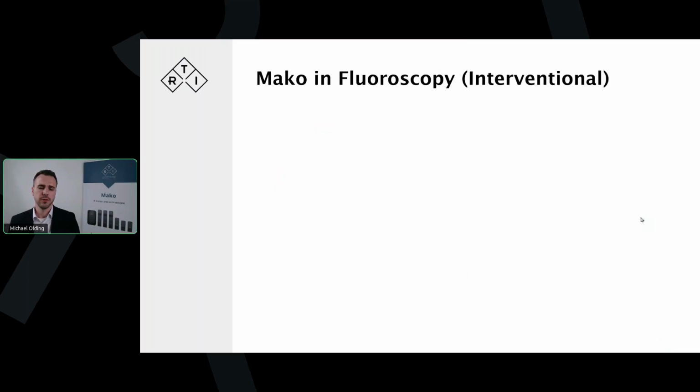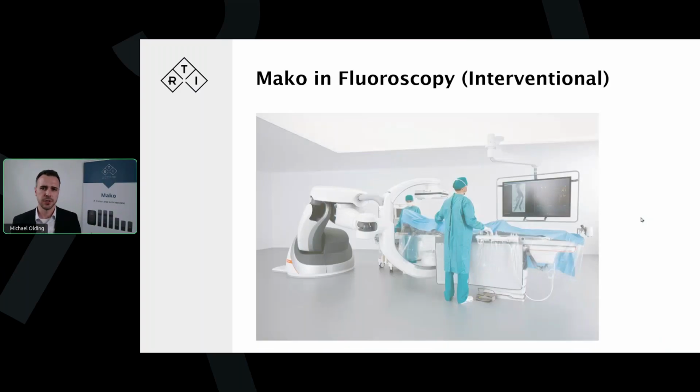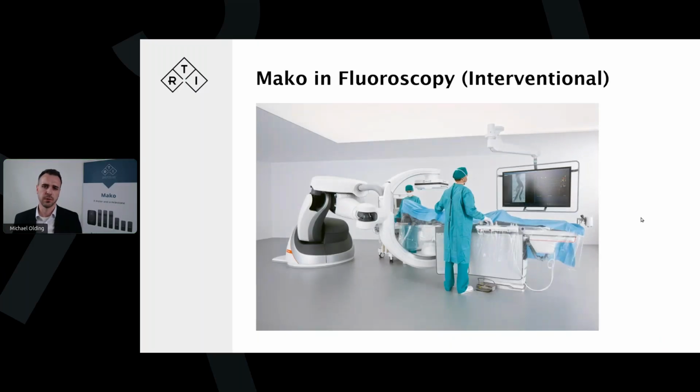So now we'll move over to fluoroscopy, also termed interventional systems, which are typically used in the surgery room. And here we're posed different challenges, whereas in radiography, we talk about single shot images. Here we talk about pulsed radiation. So in a surgical theatre or in this environment, the typical duration of the X-rays in total may be longer when we're doing the procedure, such as catheter insertion. So rather than keeping the radiation on constantly, the radiation is pulsed. So we get low dose pulses, but the total exposure time is more.